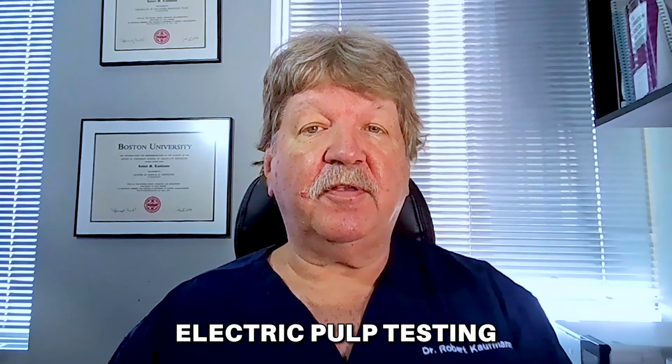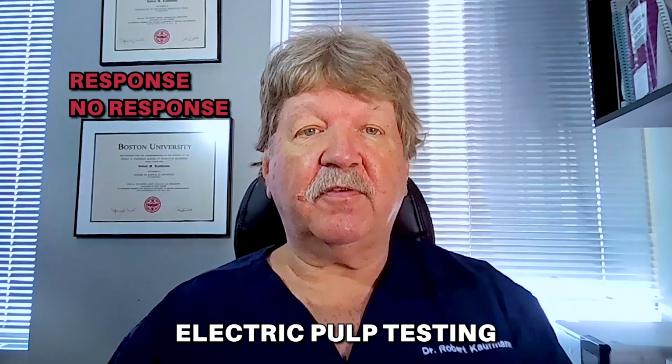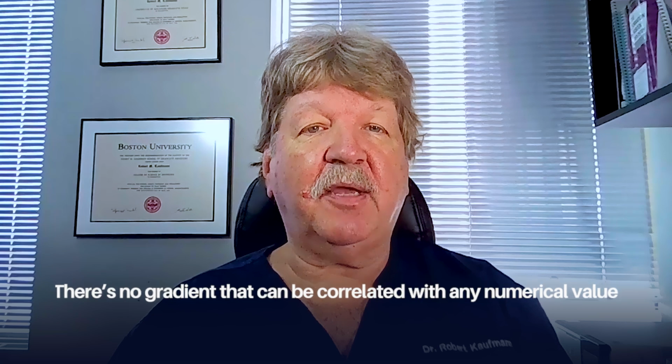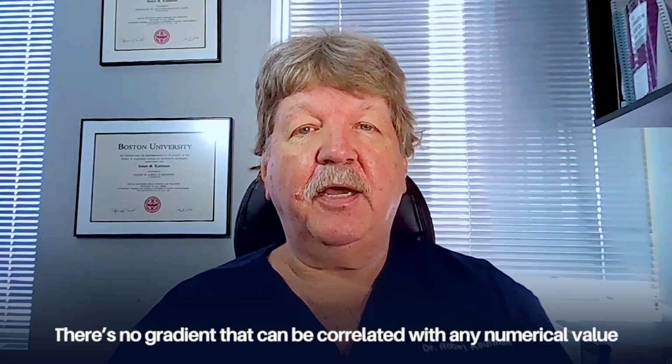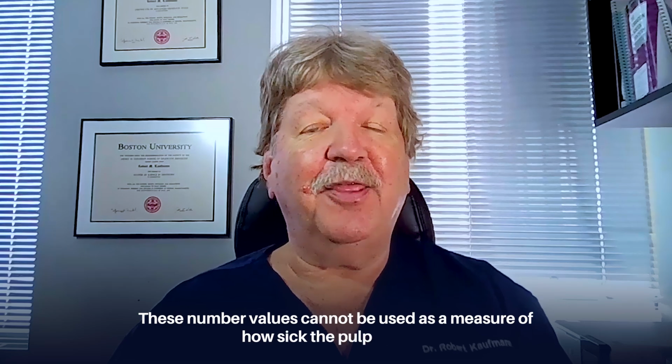The only information that can be gained from an electric pulp testing device is the possibility of either a response or no response. Yes or no. And even this may be a false positive or false negative depending upon the case. There's no gradient that can be correlated with any numerical value. In other words, these number values cannot be used as a measure of how sick the pulp may be.